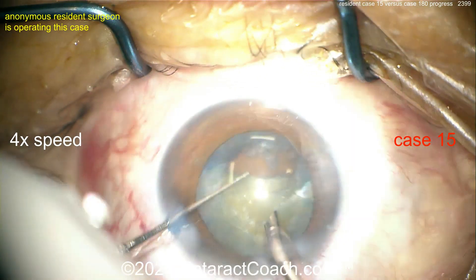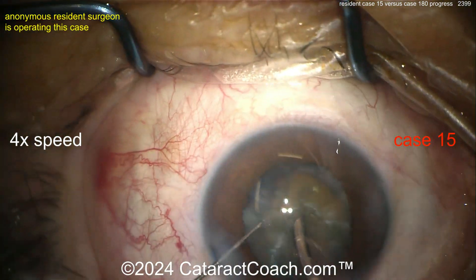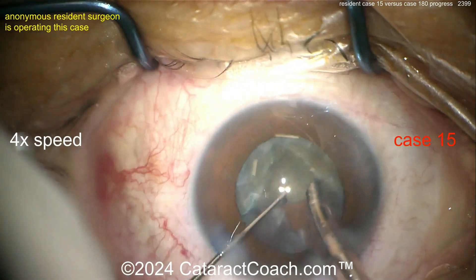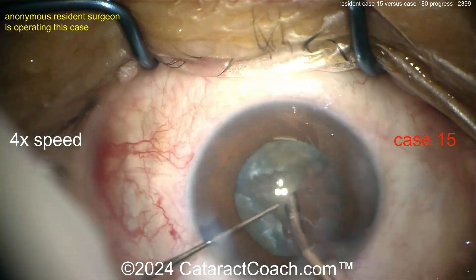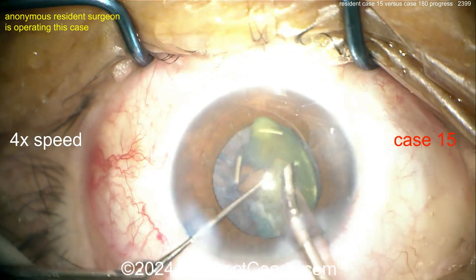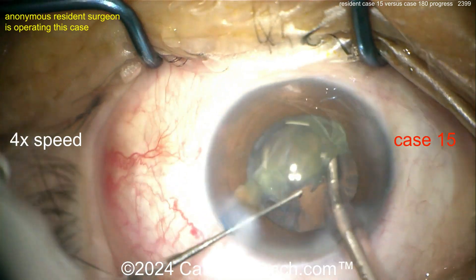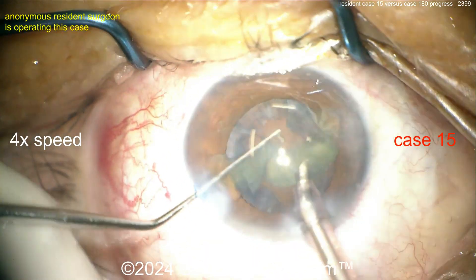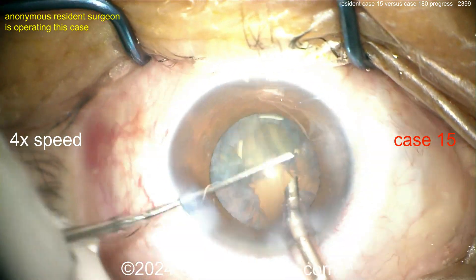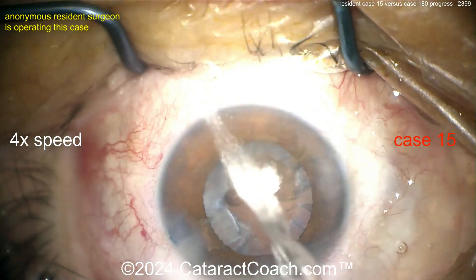My only criticism so far is the main incision is not great and the rhexis is really small, which makes life more challenging. Now — are you going to grab this and chop it? That'd be fantastic! Groove okay — divide and conquer. Bringing the piece up — that's a chop! If you are doing a chop at case 15, that is fantastic. I can't wait to see your case 180. Taking out that last bit of nucleus — that looks great, using a sharp chopper at case 15.